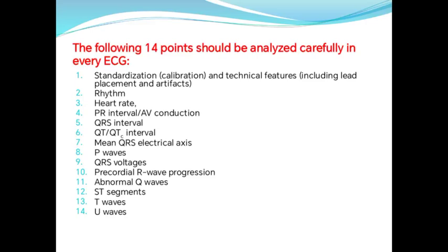And this is the hallmark of reading the ECG. I always say waves and intervals. These are waves and intervals. Okay.